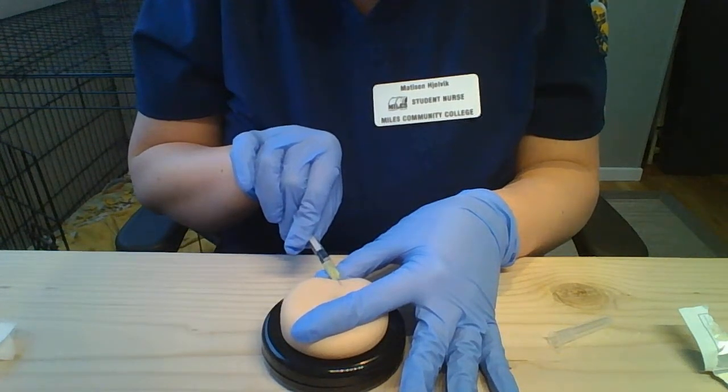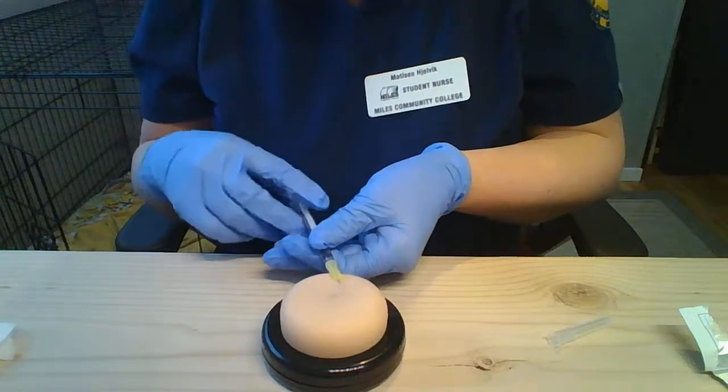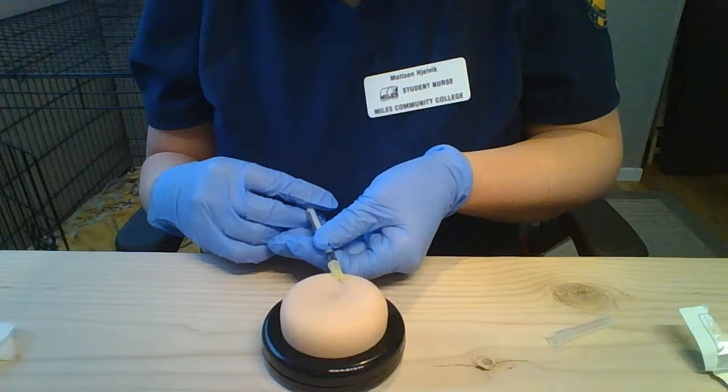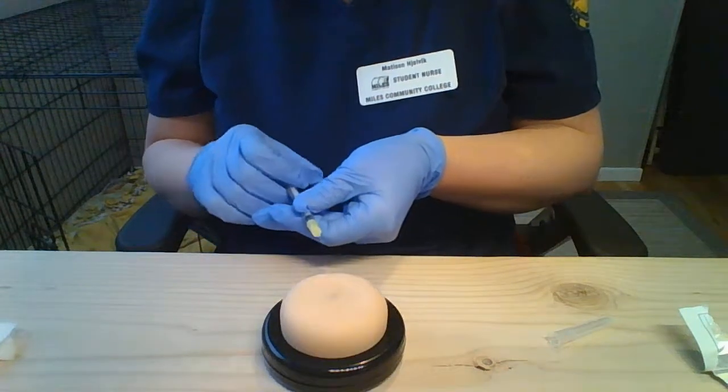So we should be able to see the tip of the needle. And then I'm going to inject slowly so that a small bubble forms, which it popped. Then I remove the whole syringe carefully.